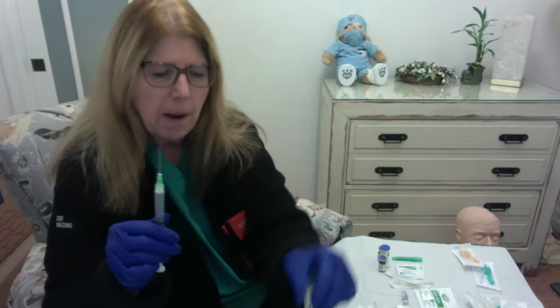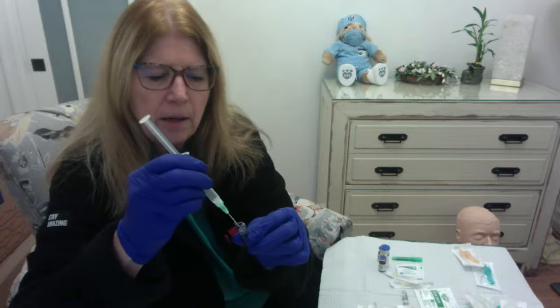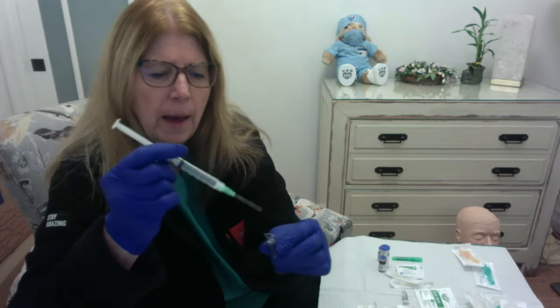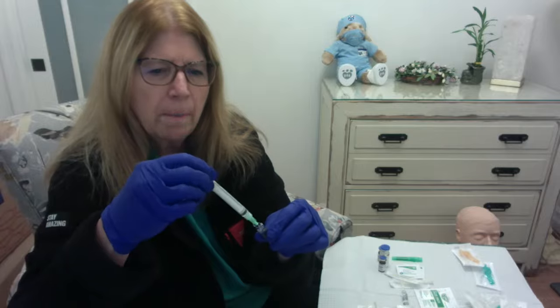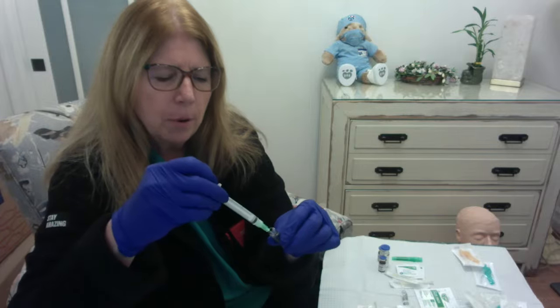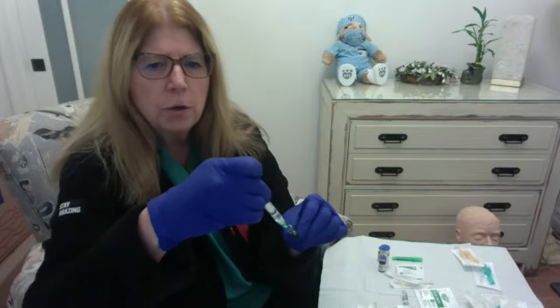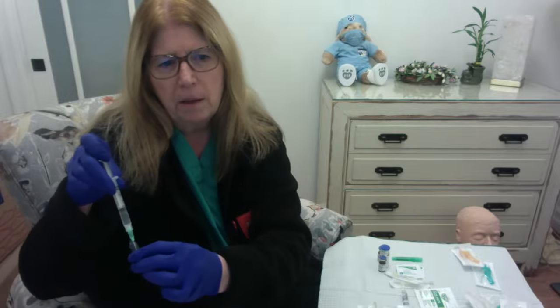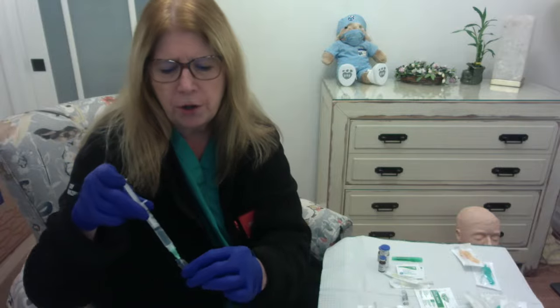Then I'm going to take my ampule, and I'm going to put my needle into the ampule, and I'm going to start drawing back on my plunger, right? As I'm drawing back on my plunger, you see I'm only touching the circular portion, right?